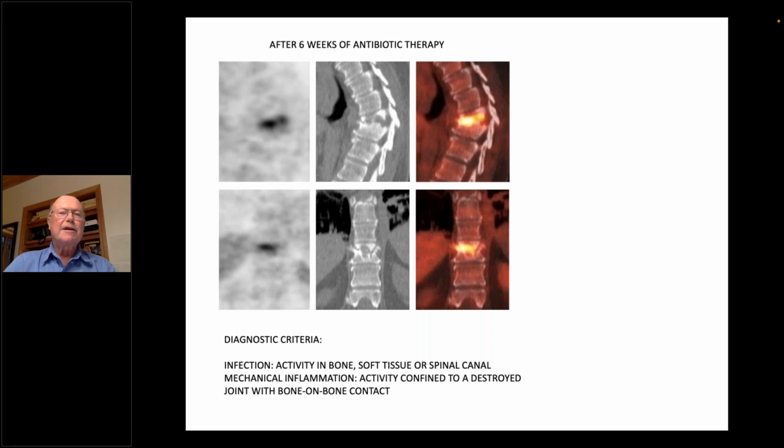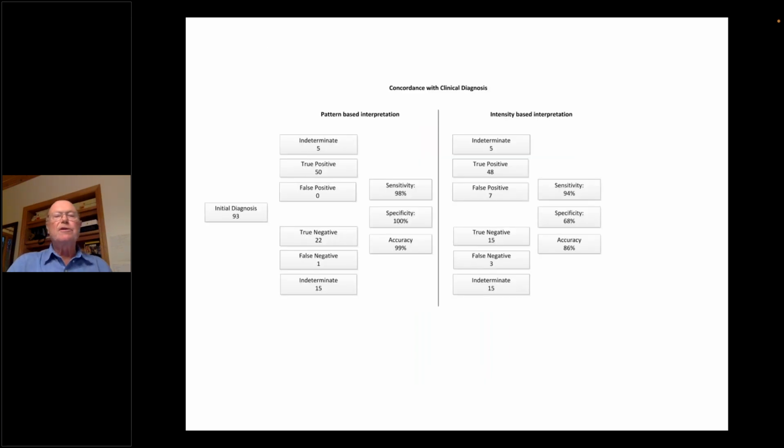A baseline examination is unnecessary to the interpretation and probably wouldn't be available in the majority of cases anyways. So we just offered it as a clinical service, as a single examination without a baseline, and it produced very high sensitivity and specificity for the diagnosis of spine infection.